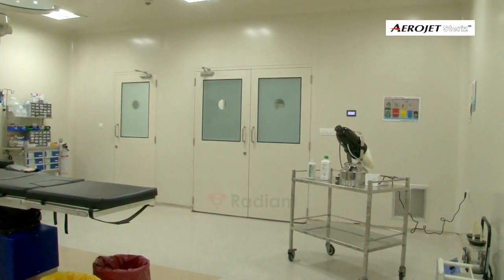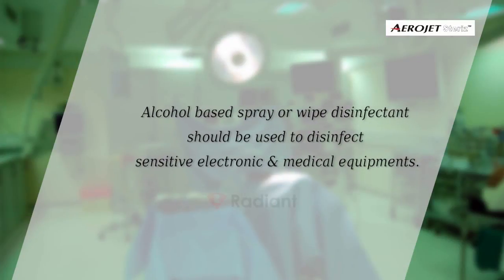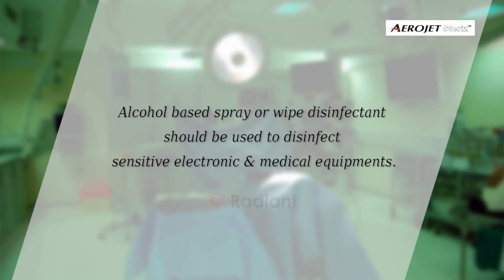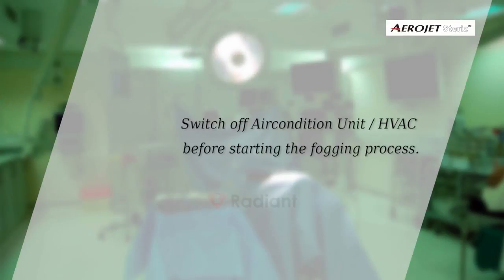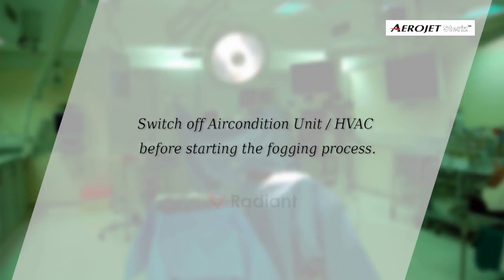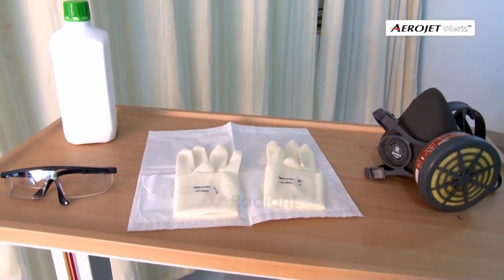and wiping with recommended disinfection solution. Alcohol and base spray or wipe disinfection should be used to disinfect sensitive electronic and medical equipment. Always switch off the air conditioning unit before starting the process. Use necessary safety equipment as recommended by the disinfectant label.